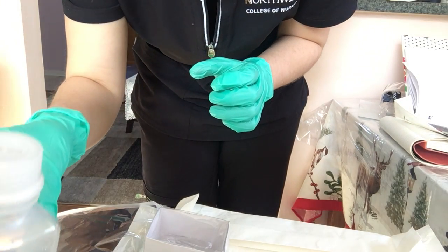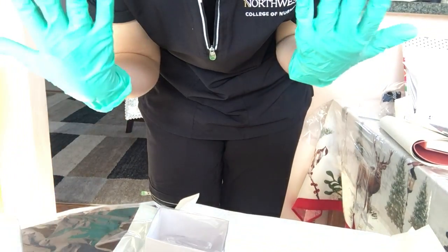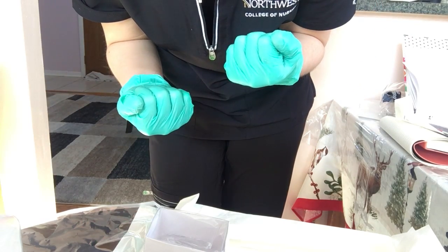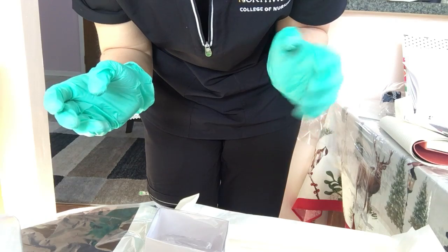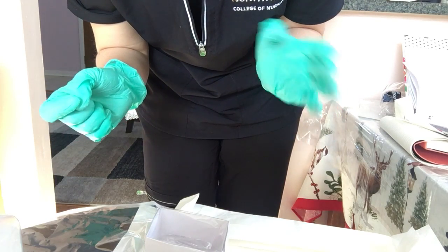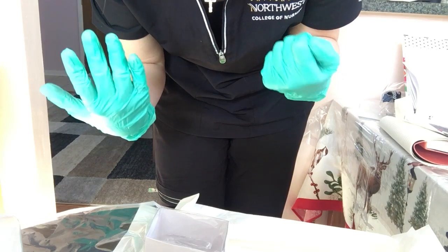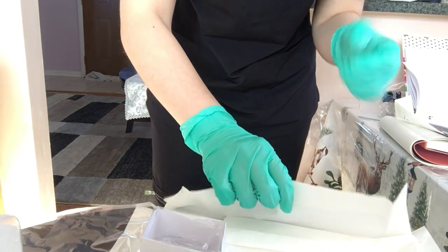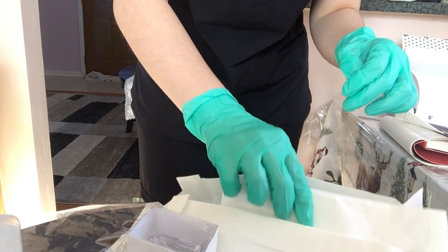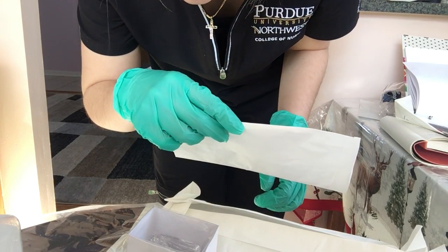Okay, and then we would put on our face shield or our goggles and mask and our sterile gloves, and the dominant hand will touch the catheter and it has to remain sterile, and the non-dominant hand is considered clean rather than sterile, and it will control the suctioning valve. So with our dominant gloved hand, we're going to pick up the sterile catheter.